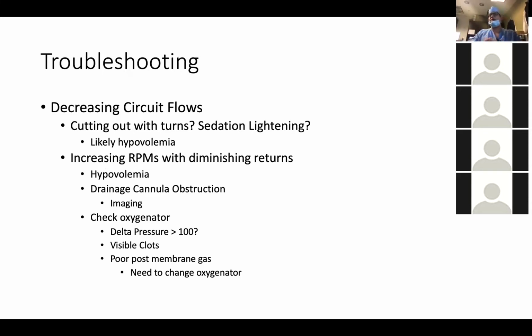We know in ARDS, every unit of blood transfused increases bad outcomes. Unnecessary fluid increases worsening of the pulmonary function and prolongs time in the ECMO circuit. So if you can turn the patient, the flow's cut out, and then you rapidly recover within a couple minutes, even the brain can handle hypoxia for 2 or 3 minutes. And sometimes you can troubleshoot this with some ventilator mismanagement.